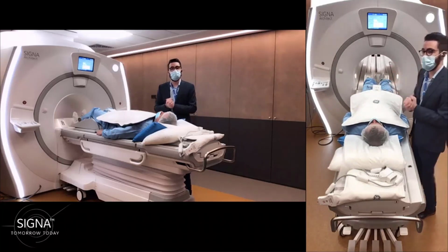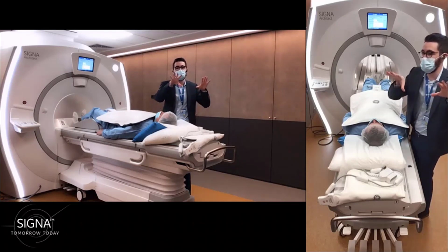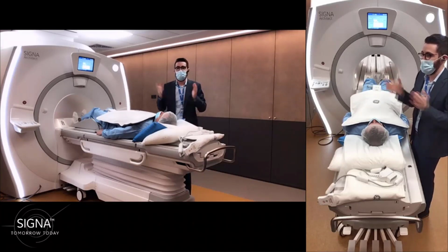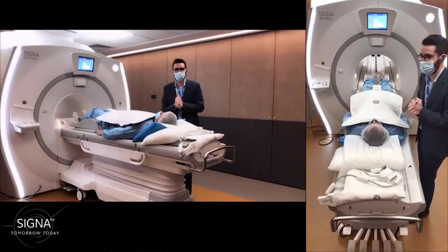So by saying that, I will let you for 1 minute because we just need now to remove the camera outside of the magnet room, and we are going to start the scanning session. See you in a minute.